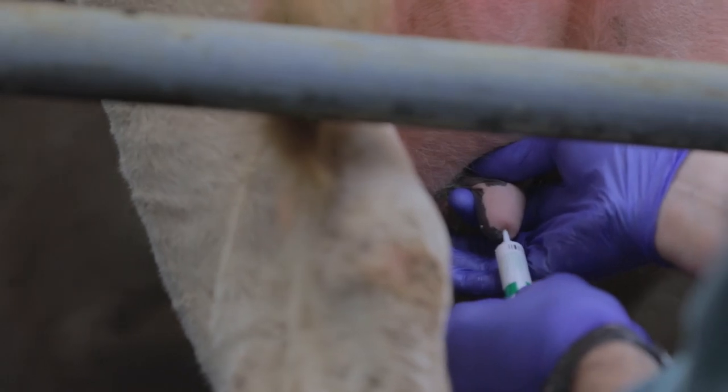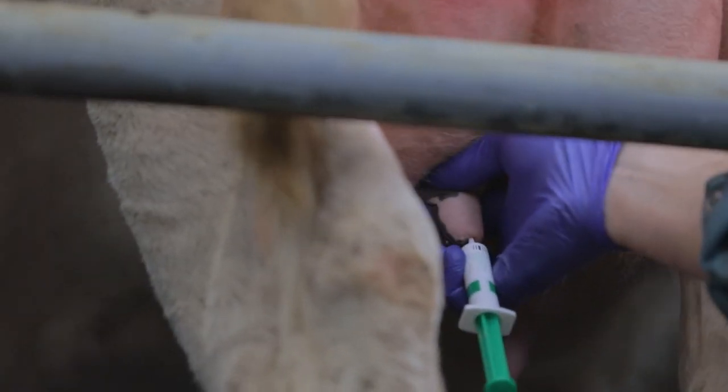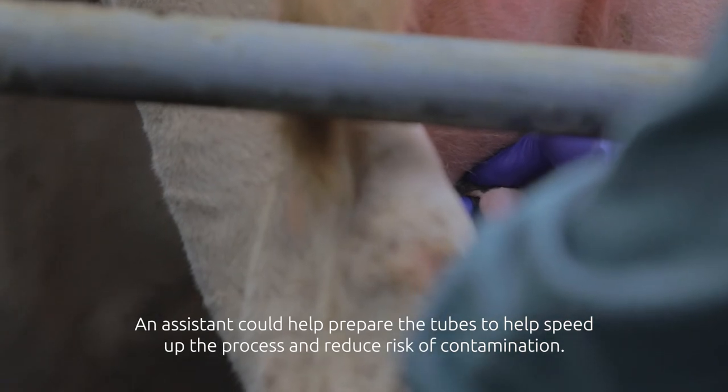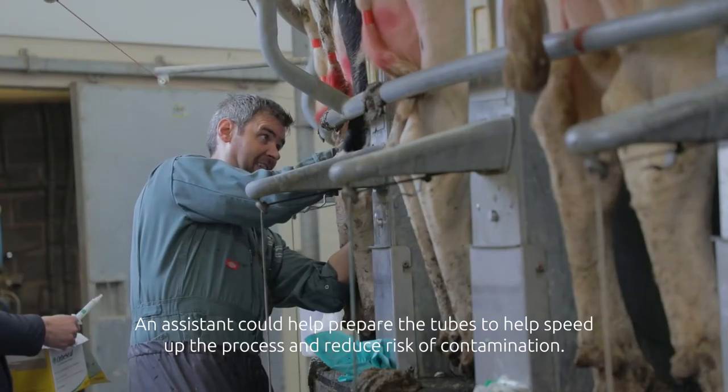The next teat to do is the back left. Visualise the teat end, partial insertion, with thumb and forefinger just gently occluding the base of the teat.